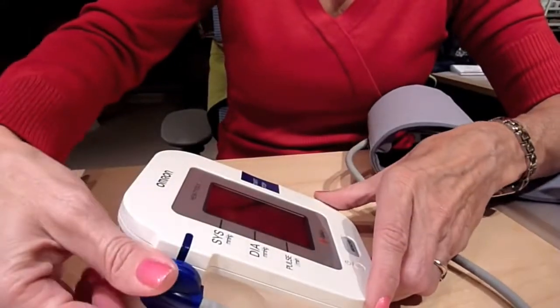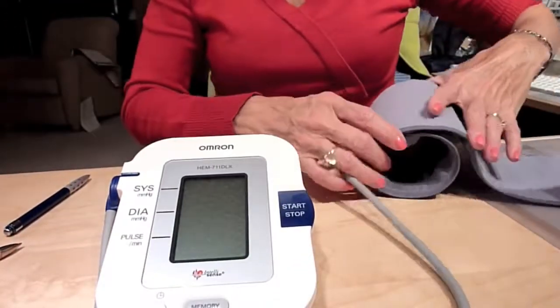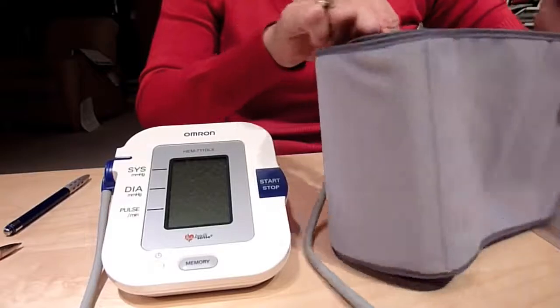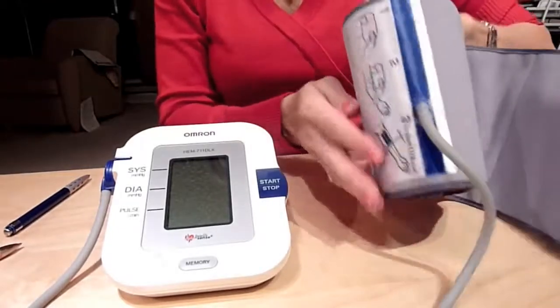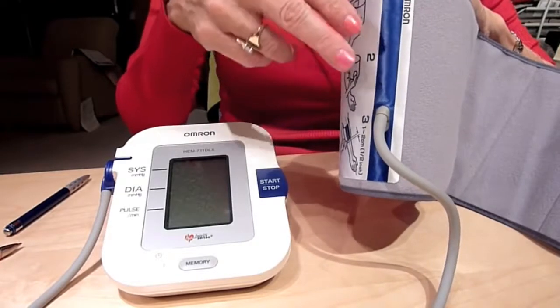On the side is where the monitor cuff is plugged in — it just pushes in, nothing complicated. This is the cuff. The cuff is a bit different with this unit. As you can see, if you stand it up, it's already round — it has a form to it, and it's also Velcro. On here it has a blue stripe, and when this is on your arm, it should line up with approximately your middle finger.